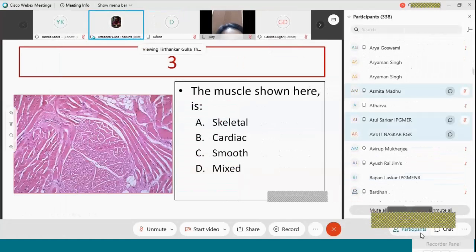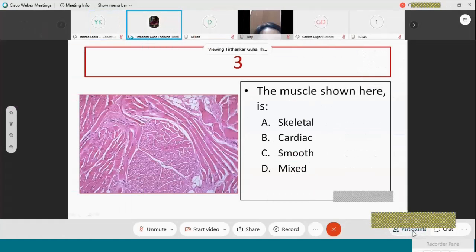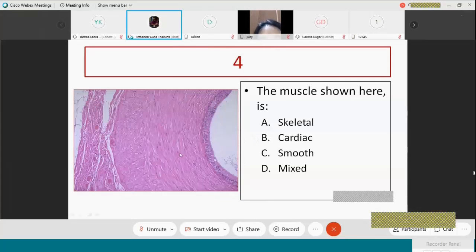The small portions that you see here are transverse sections. So they are basically cutting through the belly of the muscle. That is why they are looking rounded. And the elongated fibers are the long sections or oblique sections of the muscle. So you remember this image, this is the typical appearance of skeletal muscle fibers. What muscle do you think this one is? This whole pink area.